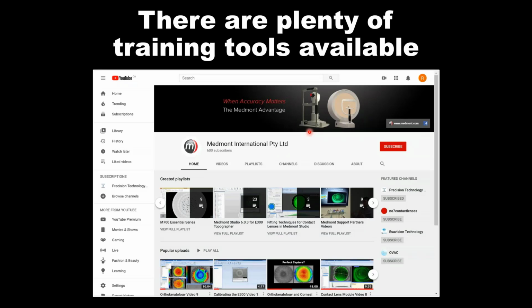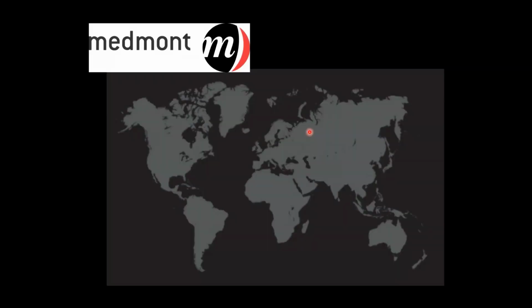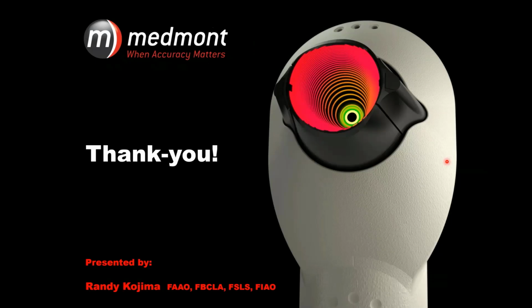expanding on a lot of the topics we've discussed today, like ortho-K, contact lens use, disease detection, capture, all of these topics. So use this as a point of reference if you want additional training. And of course, your Medmont distributor is an expert at the instrument, so don't be afraid to ask them if you have any questions whatsoever.